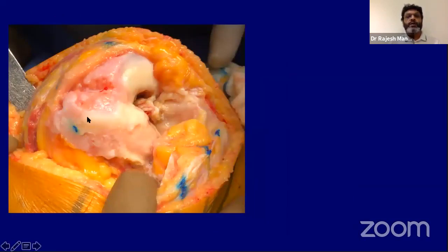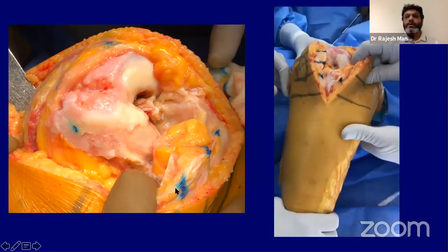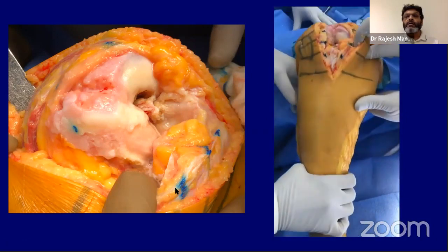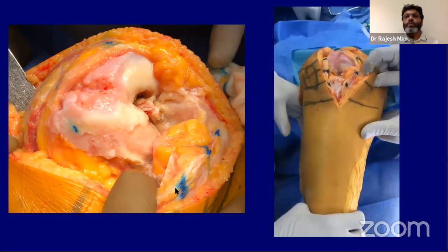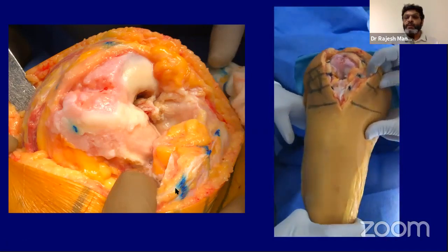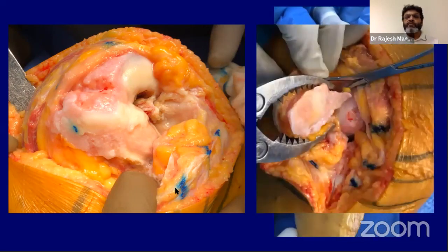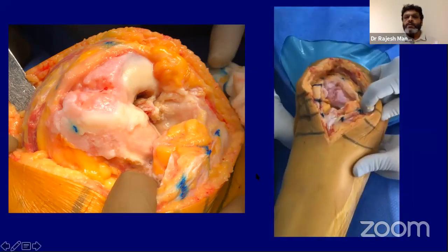This is where the trochlea is. The patella was articulating here. This is where it was articulating and staying there throughout the range of movement. Even in extension, it was not falling back into the center. Flattened patella, standard cuts.